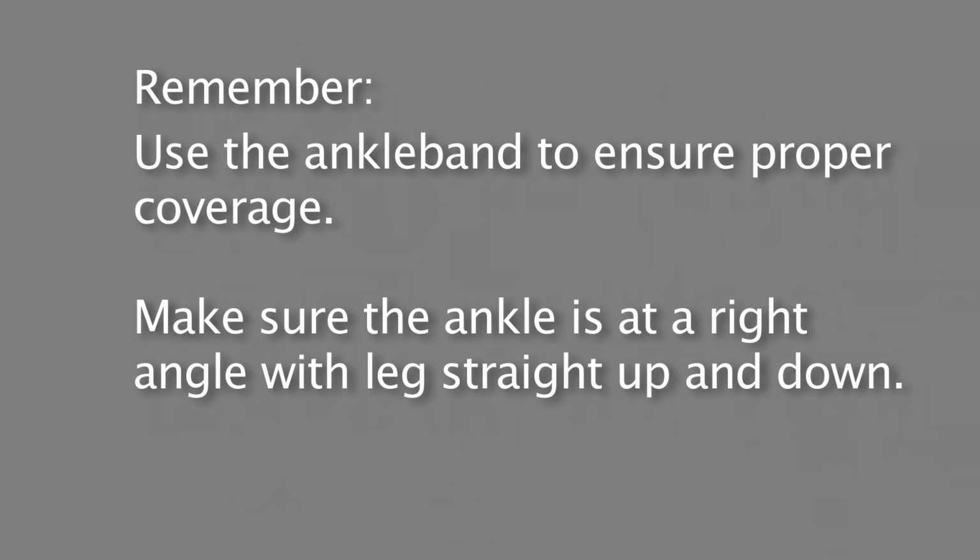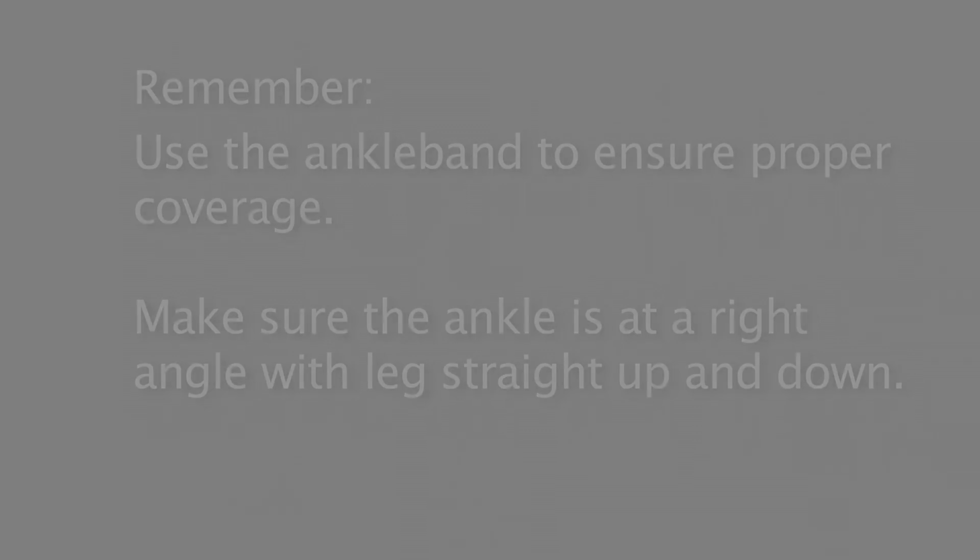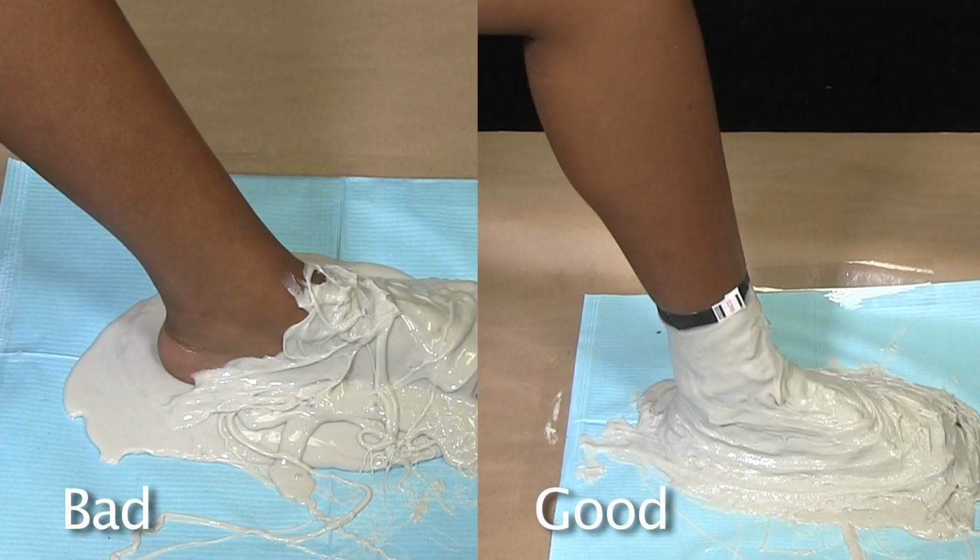Use the ankle band to ensure proper impression material coverage. Impressions without enough coverage will need to be done over. Make sure the leg is close to straight up and down with the ankle close to a 90-degree angle. Note the extreme slouched angle of the ankle on the left.